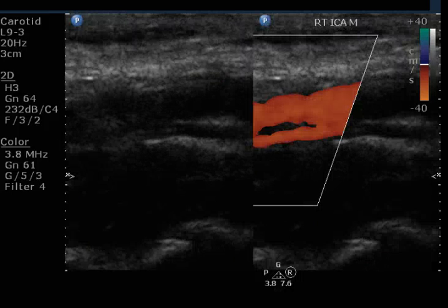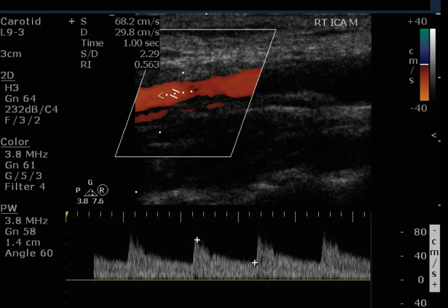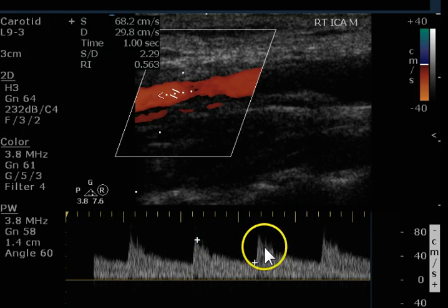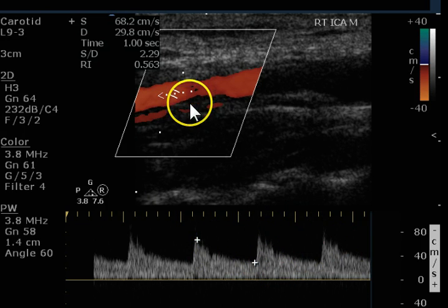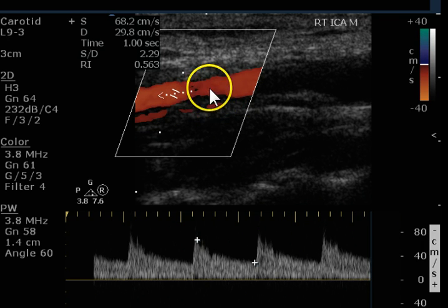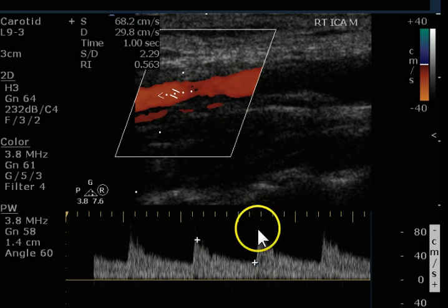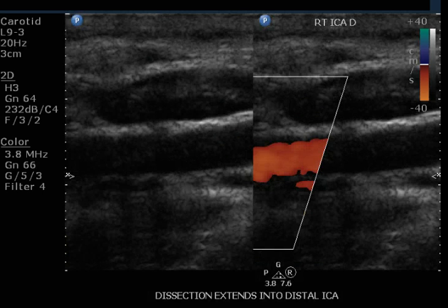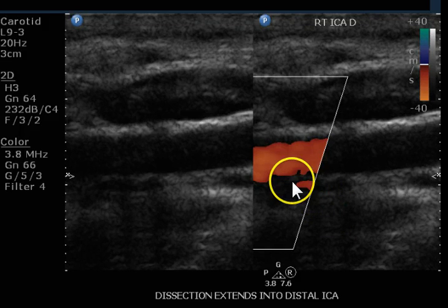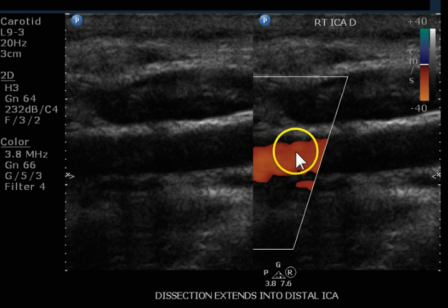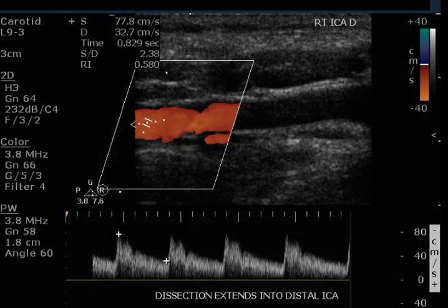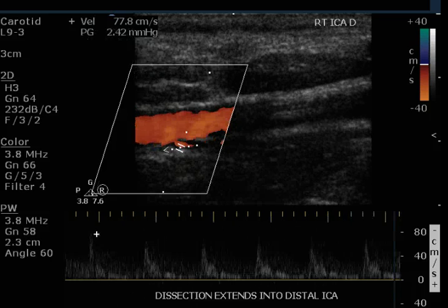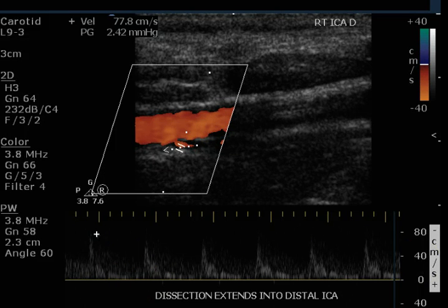One more of the ICA — this is proximal, here's mid. We still see the flap. The true lumen is still giving a reasonable signal. There's a little bit of turbulence or sawtooth here because of the motion of the flap — these things buzz up and down during systole and create some turbulence. This is an image of the distal ICA; we can still see a little bit of the flap, so it extends beyond our point of view. Here we get a signal of the distal ICA: perfectly normal for the true lumen and a high resistance signal for the false lumen.